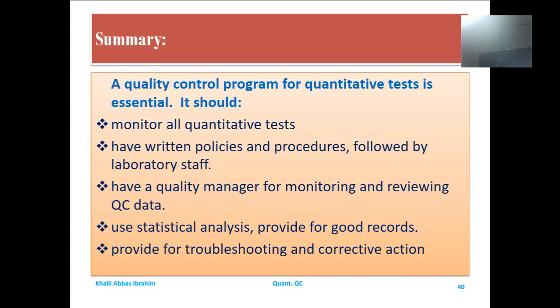To summarize, I would like to say a quality control program for quantitative tests is essential. It is very essential to control the quality of quantitative laboratory examinations, and it should monitor all quantitative tests.